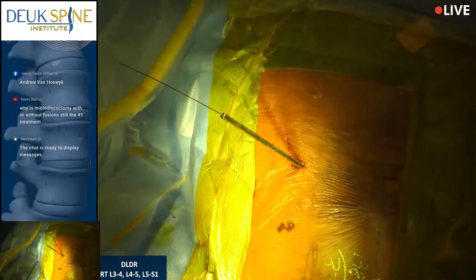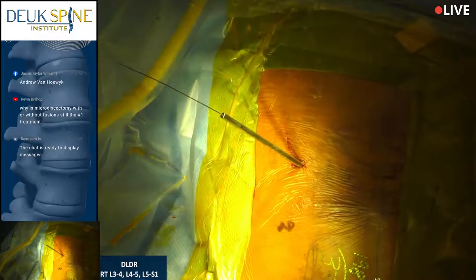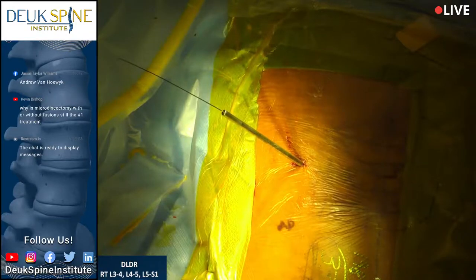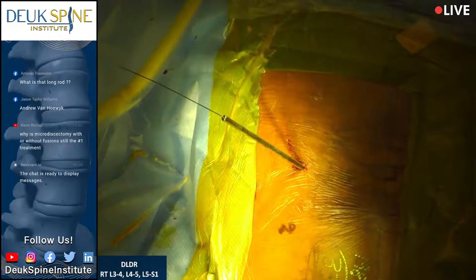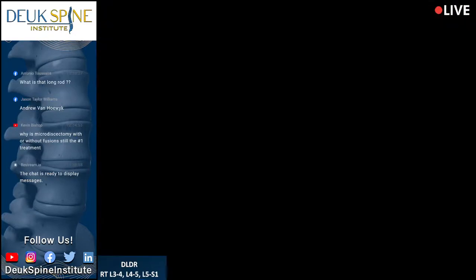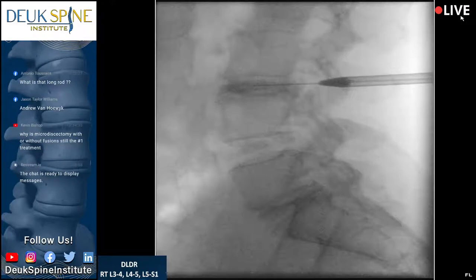All right. What do you think's wrong with the pedicles of L3, Monica? Do you think the pedicles are lined up at L3 or they're not lined up? That's because you didn't move it enough. Are the pedicles of L3 lined up? No. So what do you need to do? No, you need to move it even more. I don't see that getting any better. Are they lined up now? No. So what do you need to do?